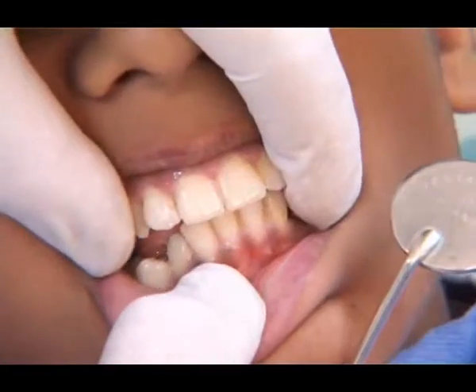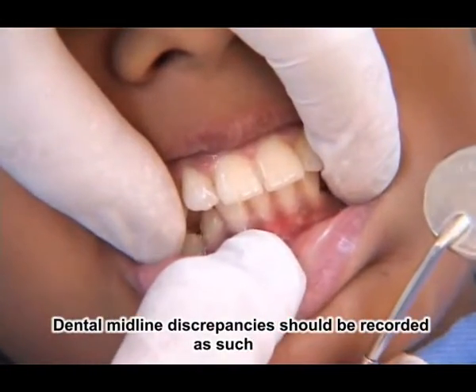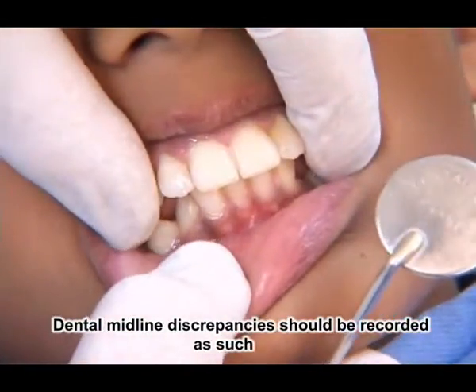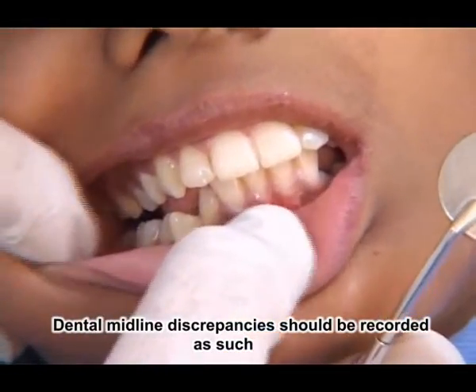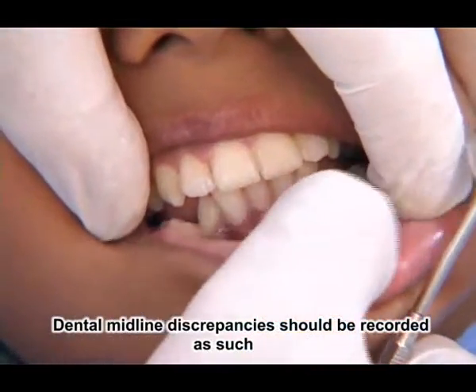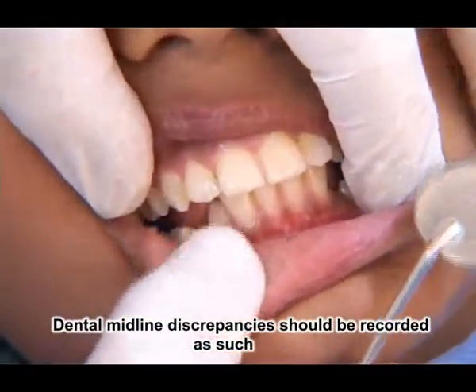If there is an existing midline shift and this midline shift is due to dental reasons, then we do not make any effort to correct the midline during recording the bite. Like in this case, we can see the midlines are slightly off, not absolutely off. So we will not make any effort to correct the midlines because we know this midline problem is due to slight crowding in the lower anterior region.